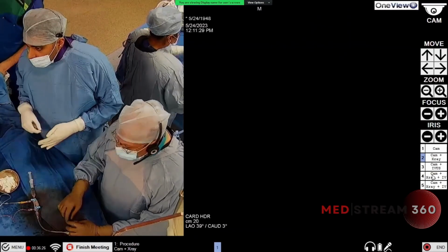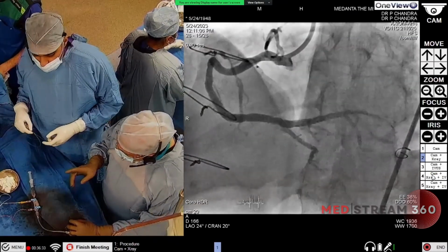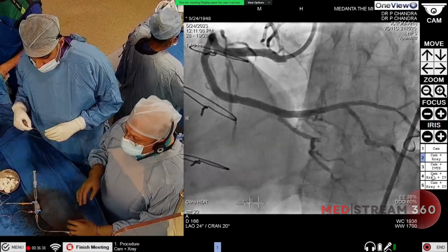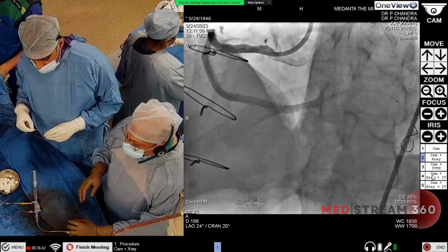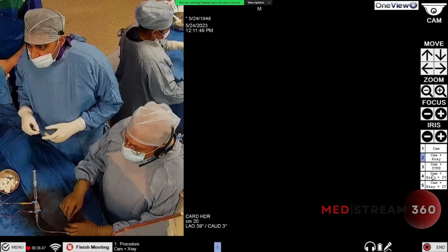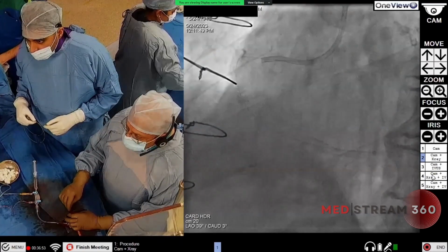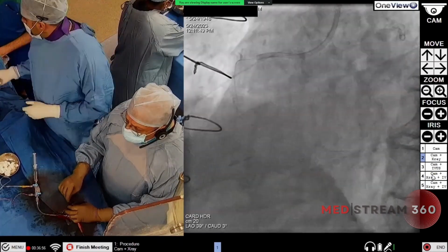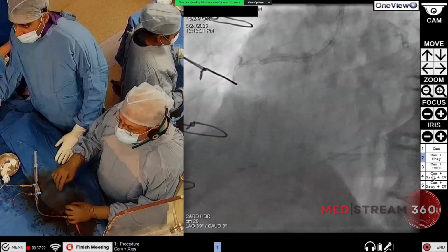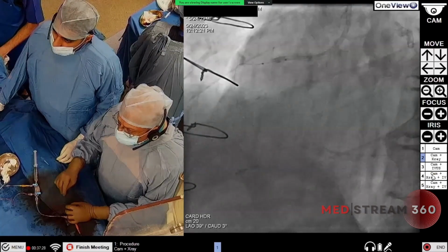So I'll take the wire out slowly, and I see there is a resistance. As I'm pulling the wire, the guide is going inside. Okay. Balloon. 2 balloon. So for this, many times what I do is we take a balloon inside so that the guiding doesn't jump too much inside. And because at this stage, sometimes this is a 7 French guide, it can injure the proximal part of the RCA, and then you'll again try to put some stents. Okay, so we are back into the middle. Now I'll pull both the things together.